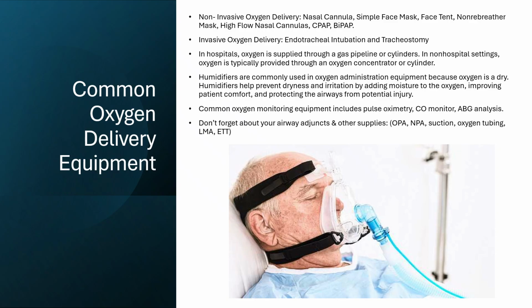So what are some things, if you're going to deliver some oxygen, what are some equipment that you might need? So first of all, we're going to look at some non-invasive oxygen delivery devices. That would be like your nasal cannula, your simple face mask, face tent, a non-rebreather mask, high flow, CPAP or BiPAP. Those are non-invasive. Invasive oxygen delivery would be things like intubation, so endotracheal intubation or tracheostomy.